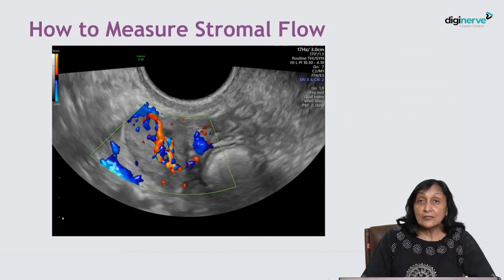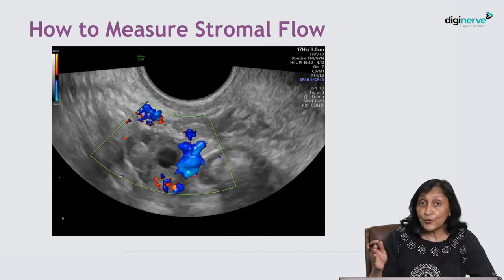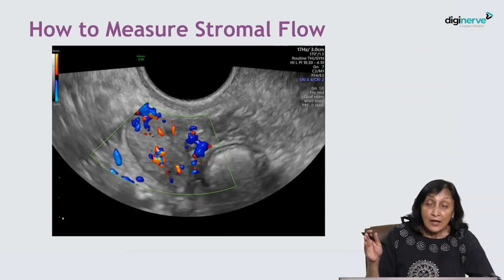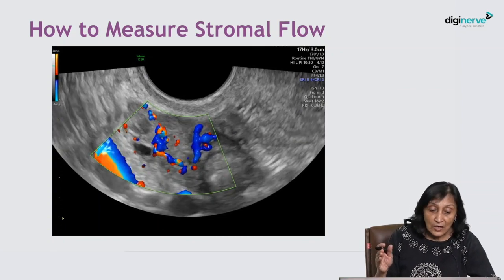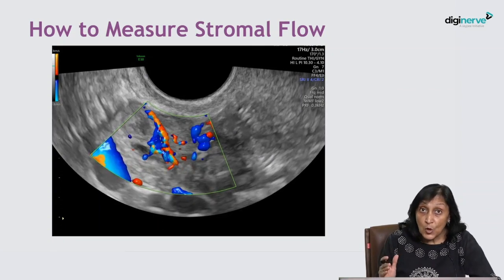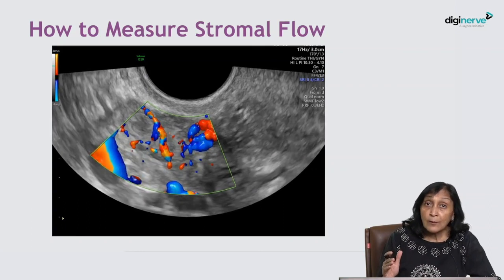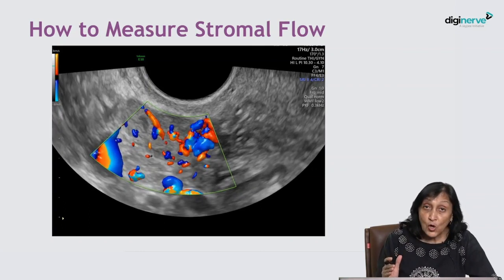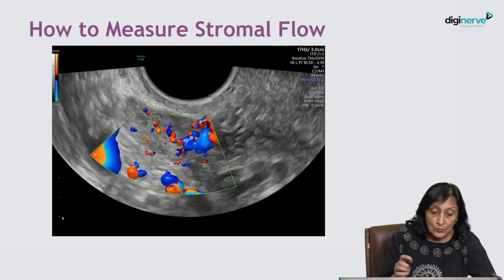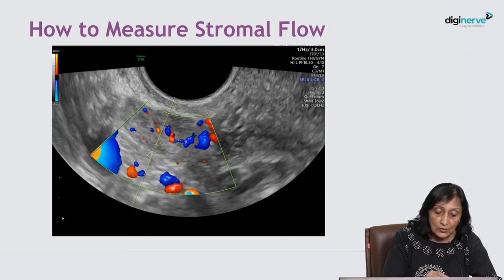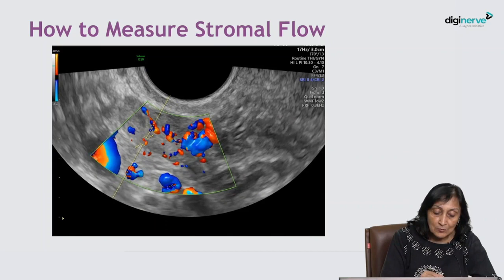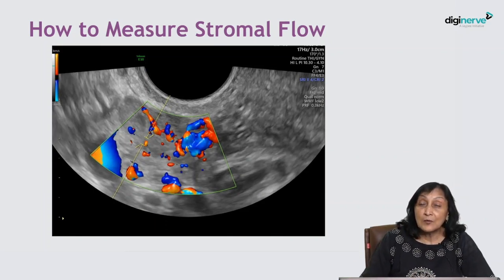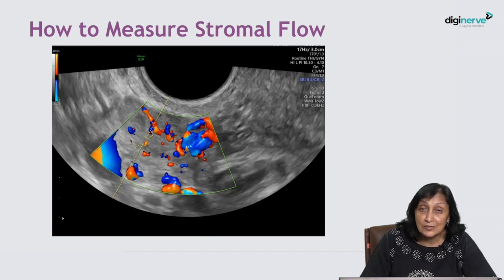From this plane you need to scroll your probe away gently, looking at the other color spots in the stroma. Once you have lost the vision of the hilar vessels, that is when you can pick up vessels which are right in the middle of the stroma — the brightest ones — and measure the flow by spectral Doppler in these vessels.